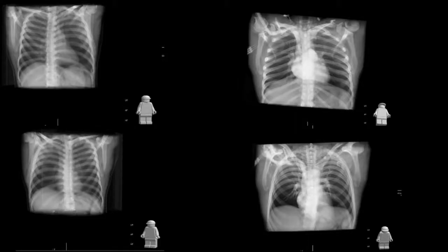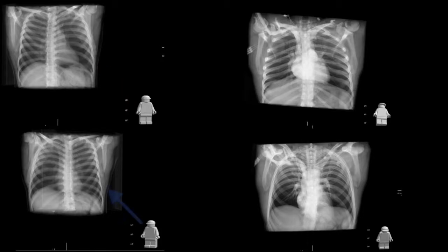Here are examples of how different patient positioning will affect the image of a radiograph. Pay particular attention to rib orientation. We have left shoulder anterior, right shoulder anterior, lordotic position, and kyphotic position.